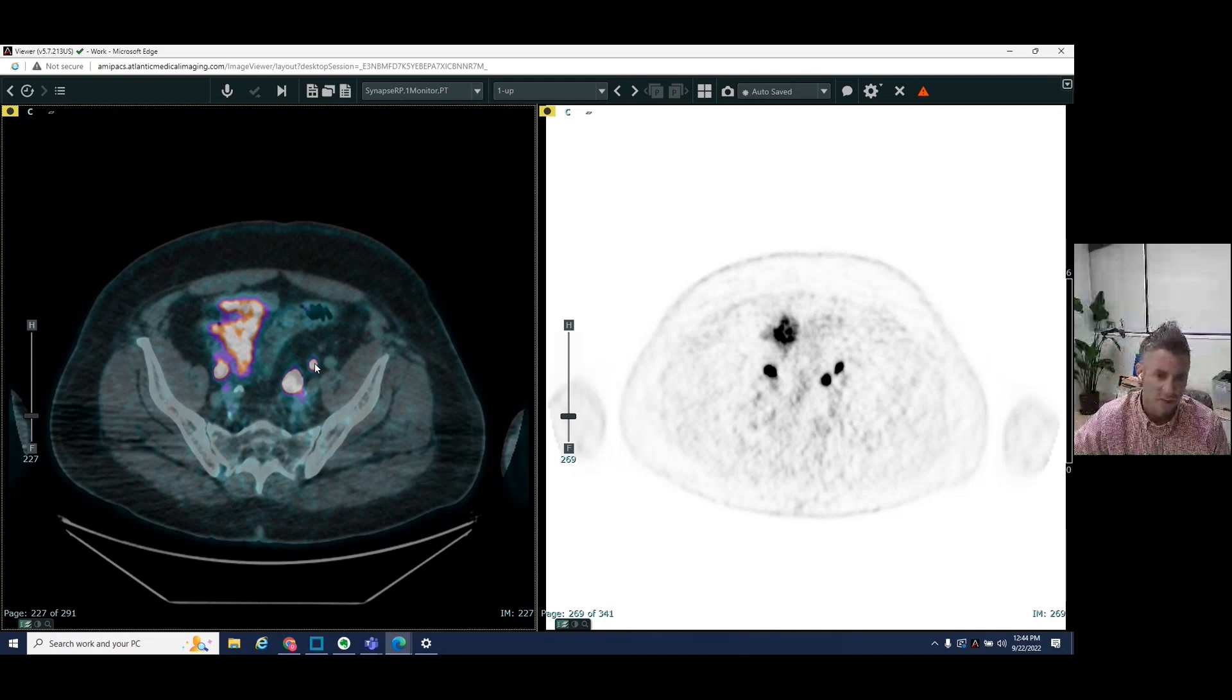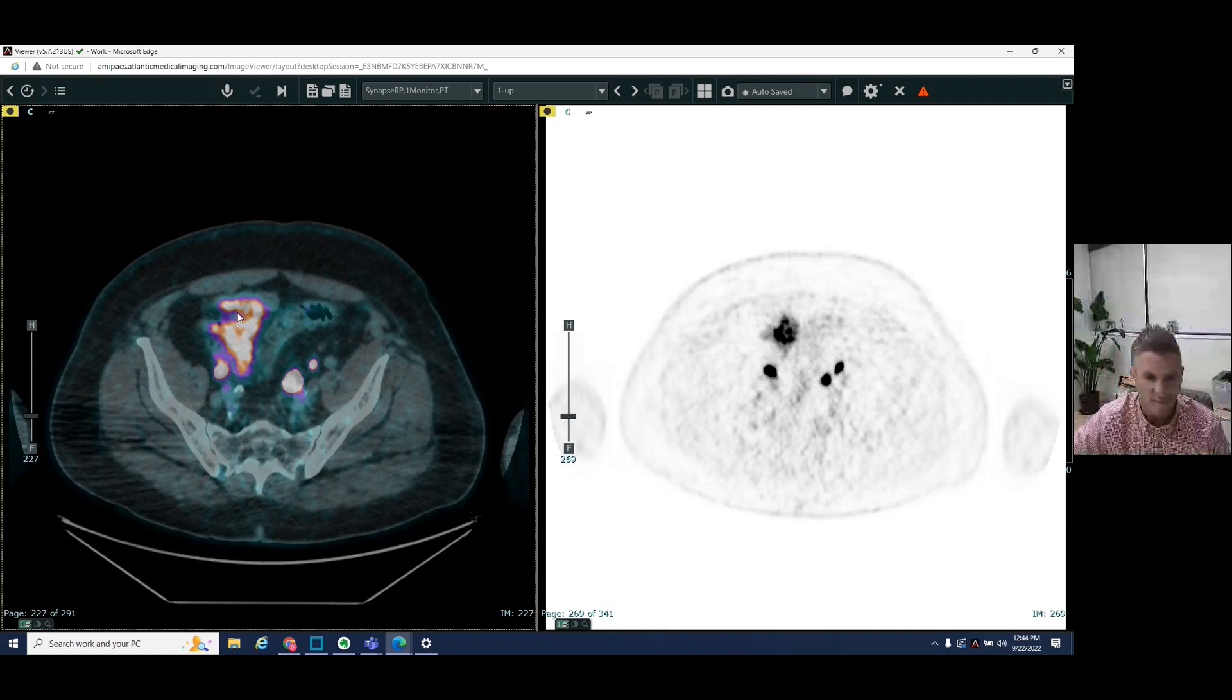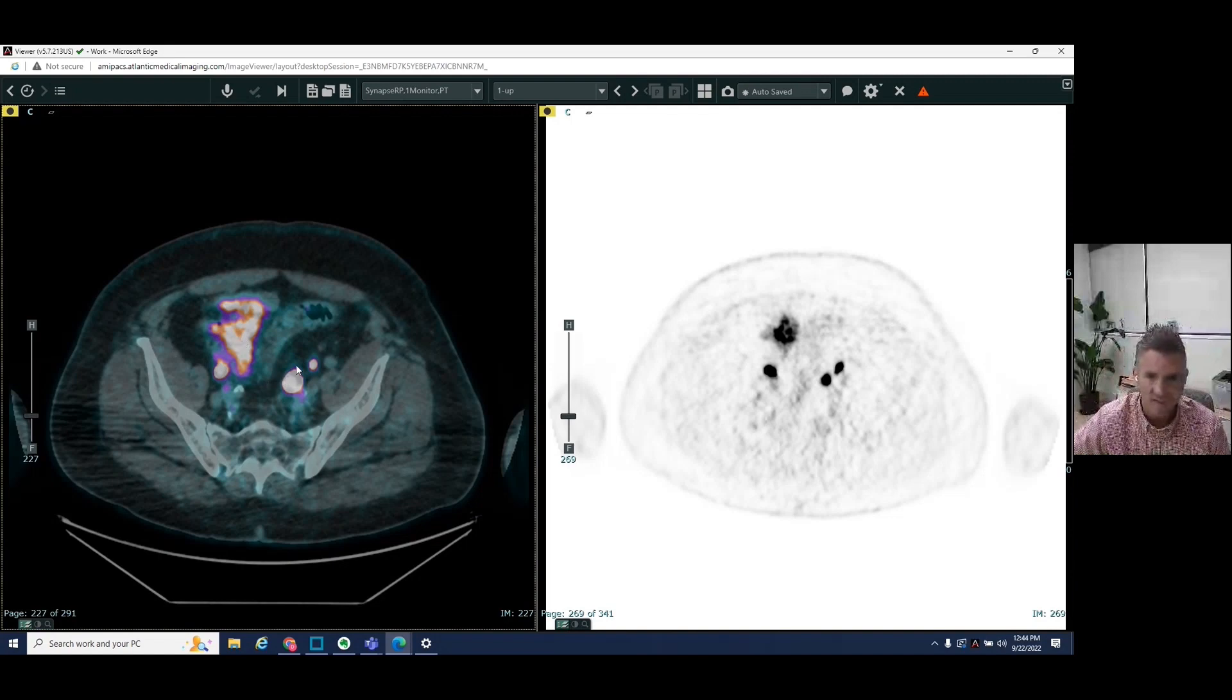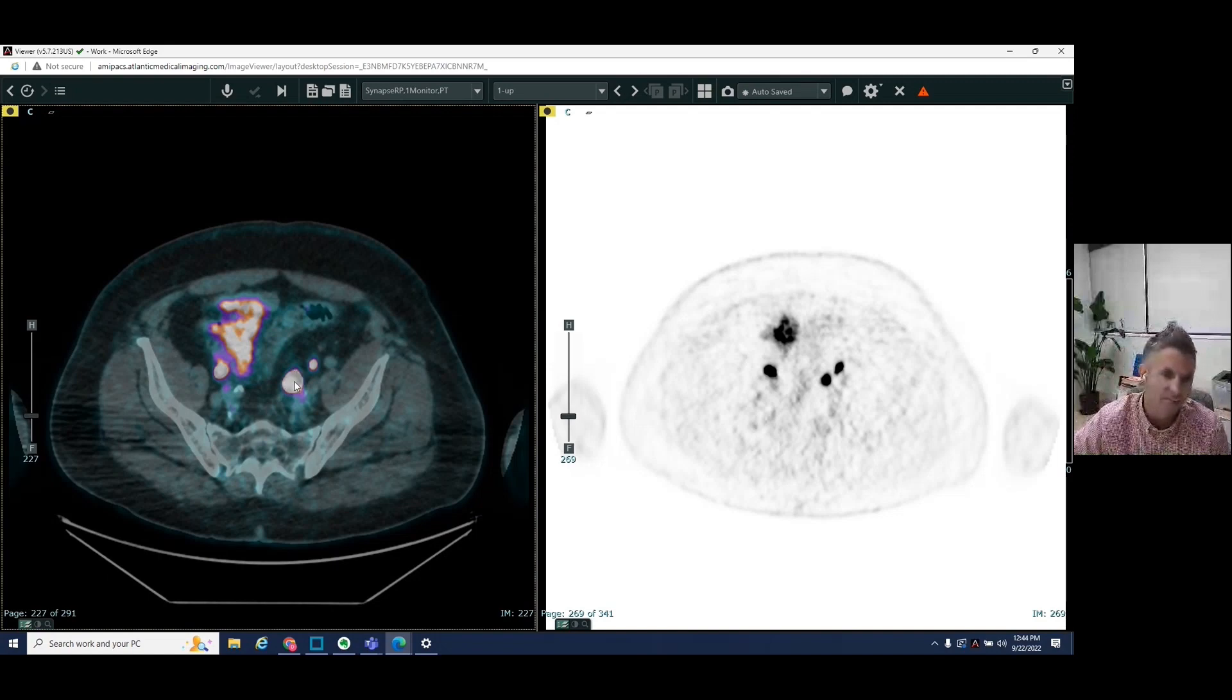Again, this is a normal ureter, which carries the urine from the kidneys to the bladder. Normal right ureter. We see some more normal physiologic uptake in the bowel. So we expect that, but we don't expect this. This is a left internal iliac lymph node, rather, which is hot.